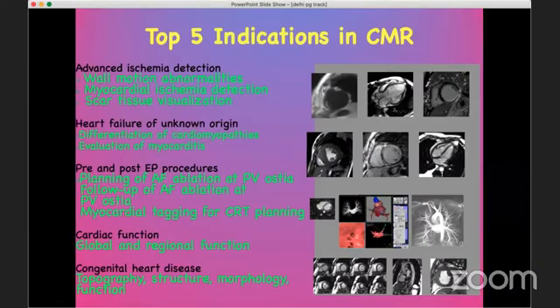The second important disease that we look at in MR, and this is something that is very unique, is the ability to isolate, evaluate, and also look at the prognosis of the non-ischemic cardiomyopathies, which incidentally we are seeing more of as the days go by, and also a very specific cardiomyopathy, which is myocarditis, and all of you have been seeing a lot of it in the pandemic, which happened over the last 1 year.